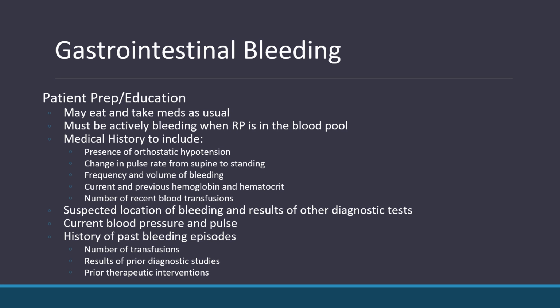The patient prep for that, they can eat and drink their medications as usual. This is one of the few GI tests where they don't need to be NPO. They must be actively bleeding when the radiopharmaceutical is in the blood pool.